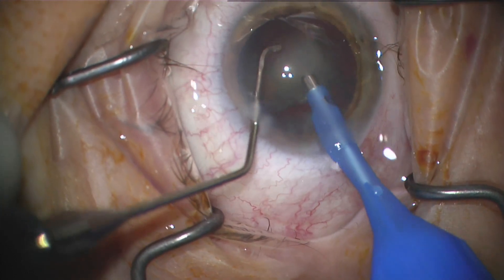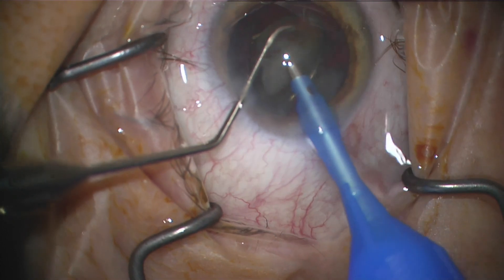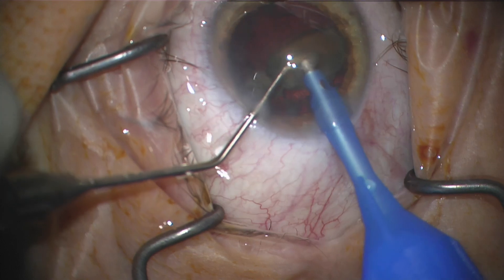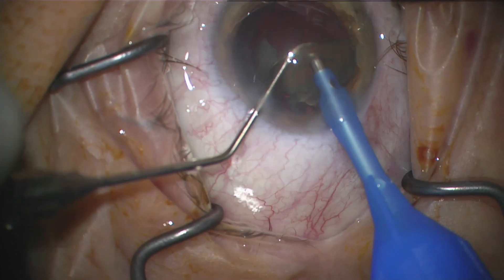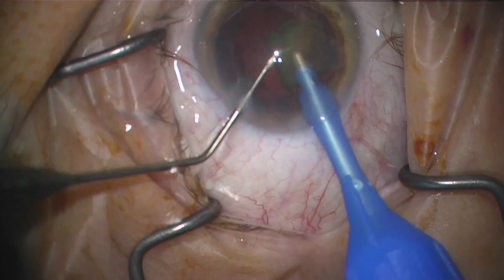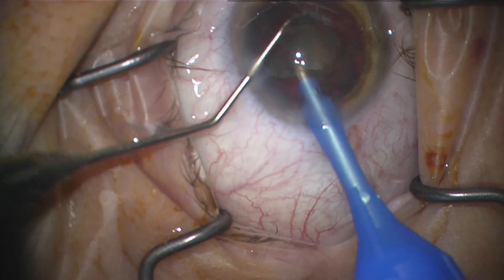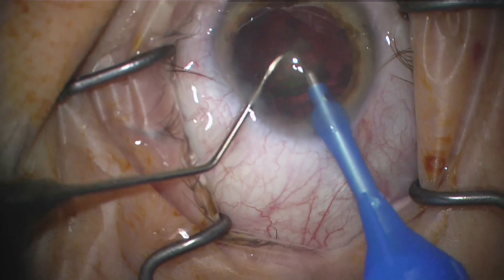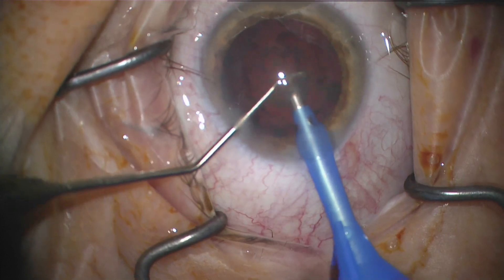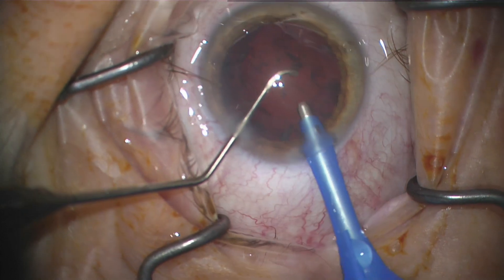One thing you can't hear here but will be able to later: I'm going to show you the sound this thing is making. It's pretty loud — it makes a really loud clicking noise when it's going, and depending on how much you're pushing down on the throttle, the noise is louder. That's something to get used to because it can be a little annoying versus the melodic tunes of other phaco machines.